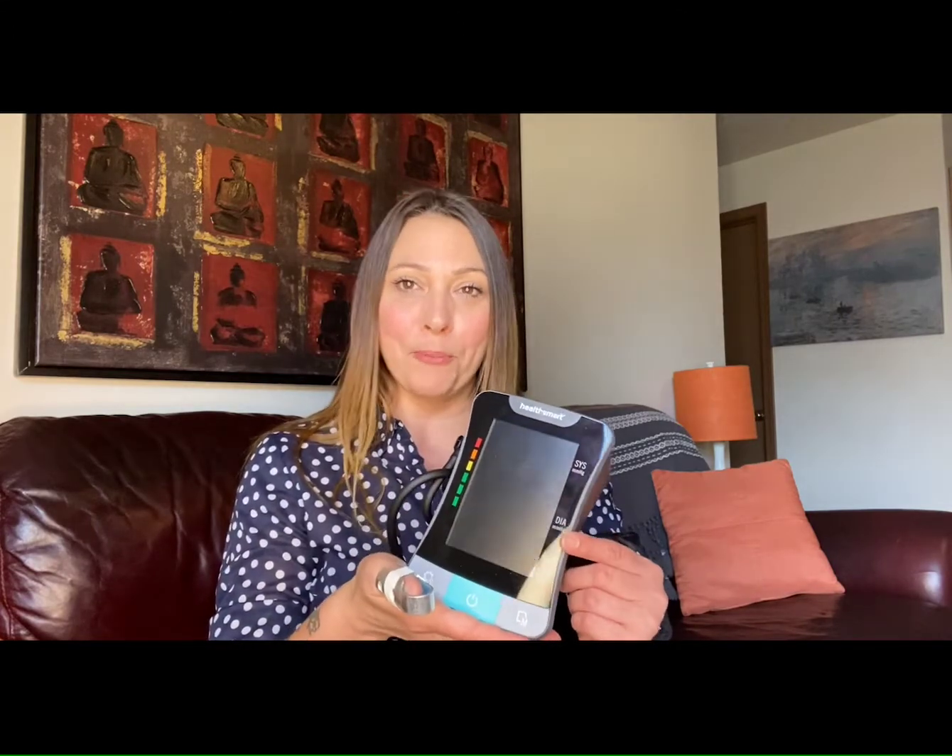Today I want to tell you about the HealthSmart Talking Blood Pressure Cuff. Now there are a lot of reasons why individuals may need to take their blood pressure and report it back to their physician every day, but what would you do if you were low vision or blind and had no way of reading your actual blood pressure on the cuff?